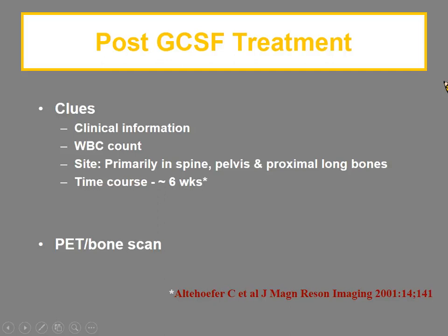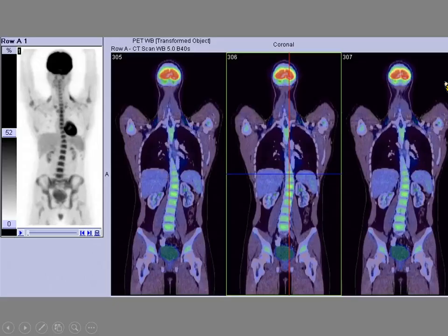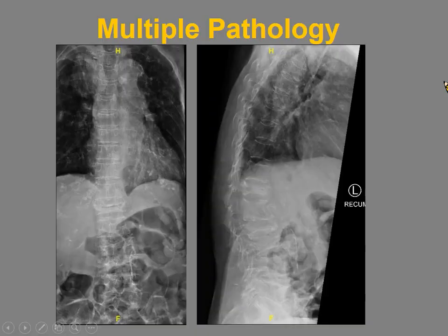Now, you don't normally need to do a PET or a bone scan in these patients, but as I've said, in oncologic patients, they may have these scans for other reasons. And if they do, and if you look at the scans, you find that for bone scans, they are usually unremarkable, or in PET scan, you may just have very diffuse marrow hyperplasia and no localized lesions.